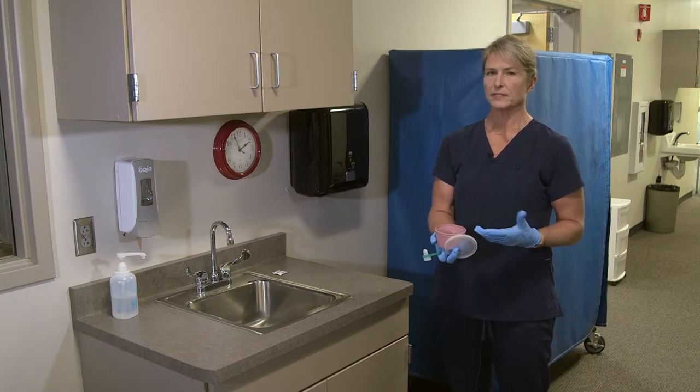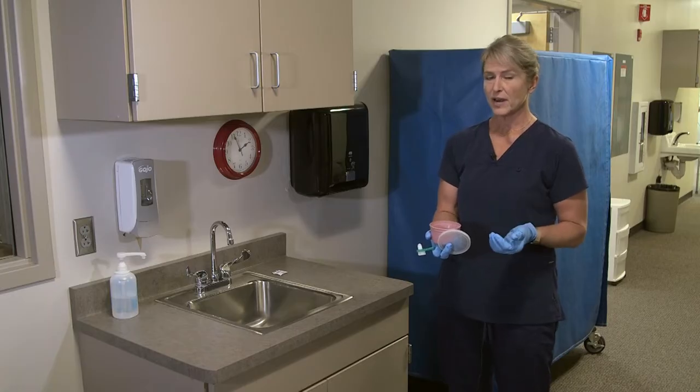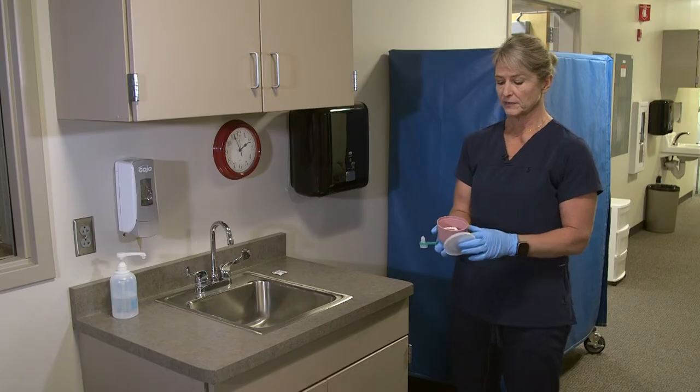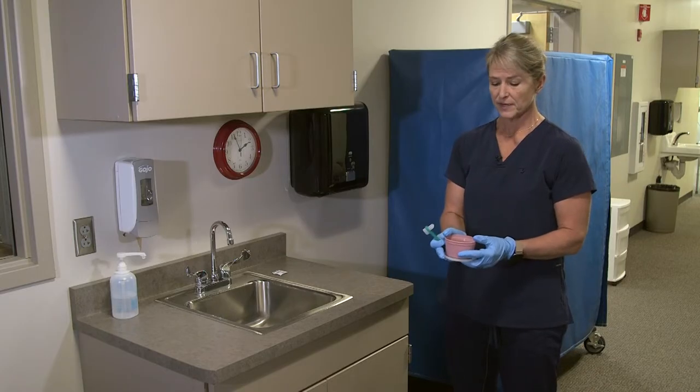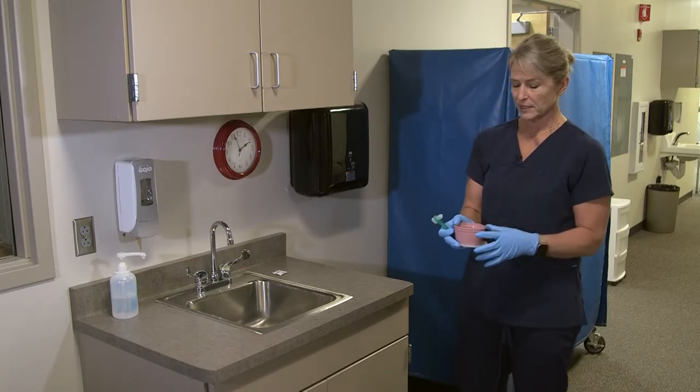Dentures are very expensive, so we don't want to walk across the floor with them. If they drop on the floor they can crack, and they're very expensive to repair. It also takes a fair amount of time, which means that person doesn't have their teeth to eat and to speak clearly.